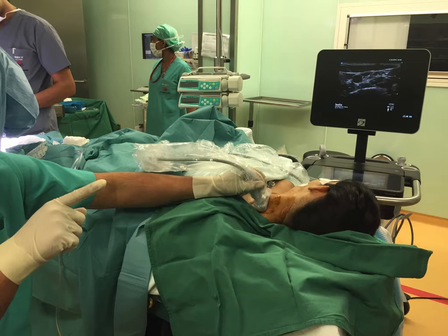The length can be up to half a centimeter to 2 centimeters. Some books say 2.5 centimeters, but you don't see it. It's flat, triangular, sometimes described as wedge shaped. So even in ultrasound you probably don't see it, but what you see is the longus colli muscle.